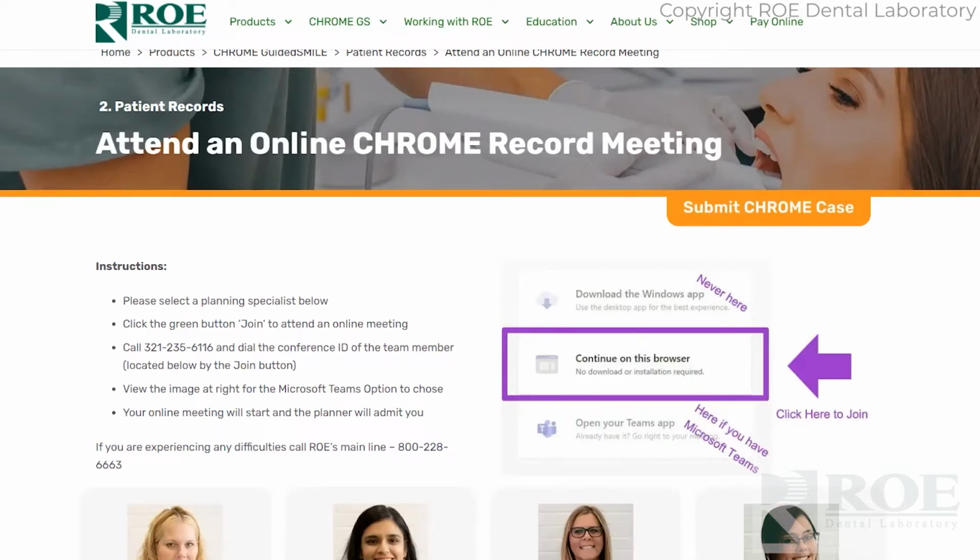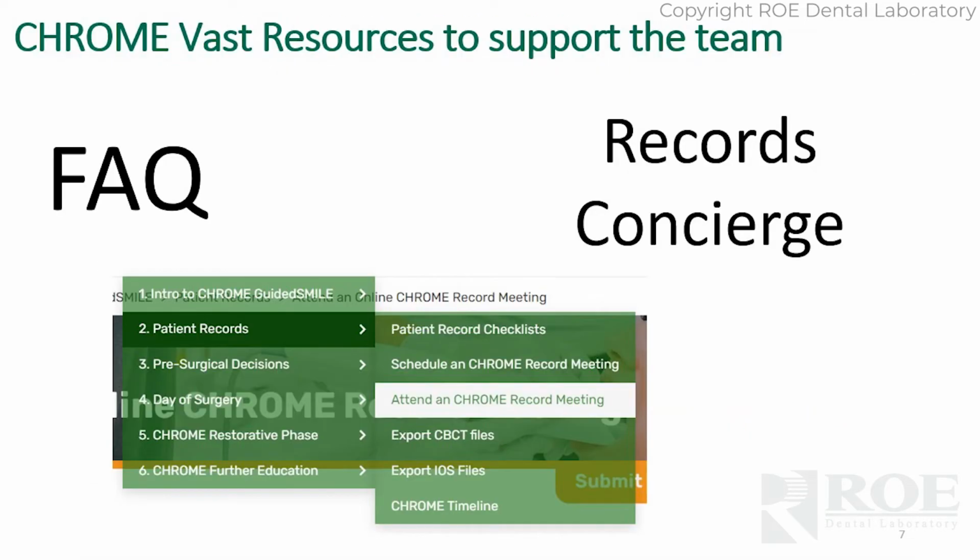Show us your CT scan. Show us the digital impressions that you captured. Show us your PVS impressions. Show us what you're going to export. Show us the photographs you took. So instantly, while the patient is in the chair or out in the waiting room, verify your records. Very, very helpful way to ensure that the records are coming over properly.